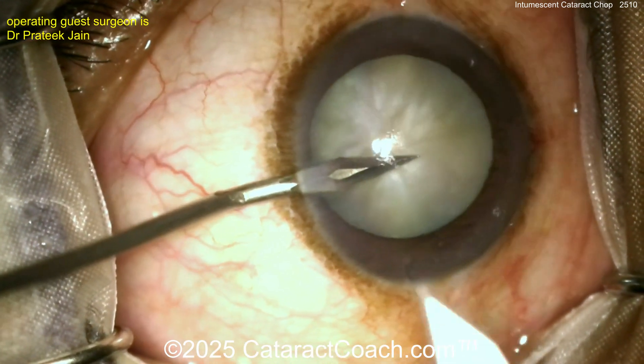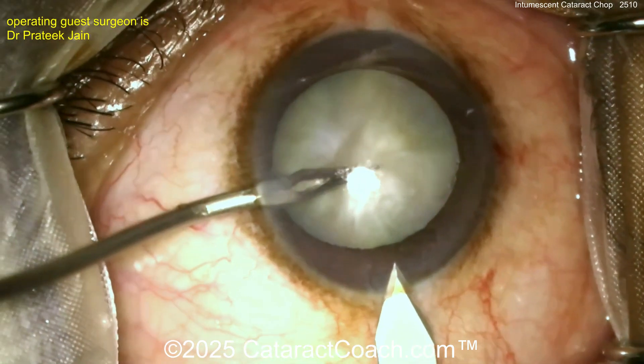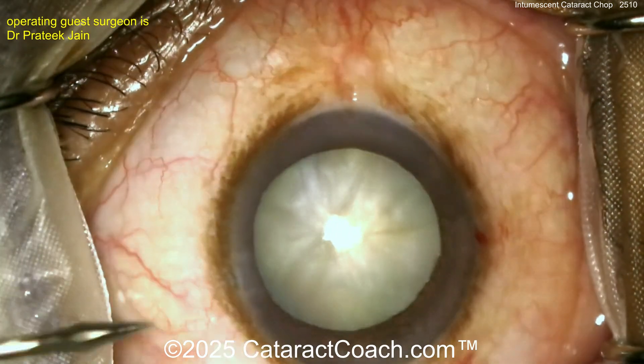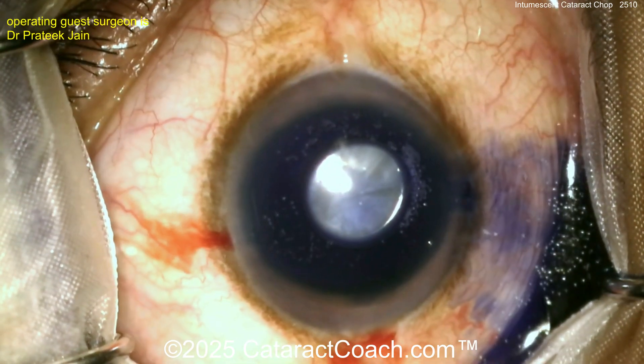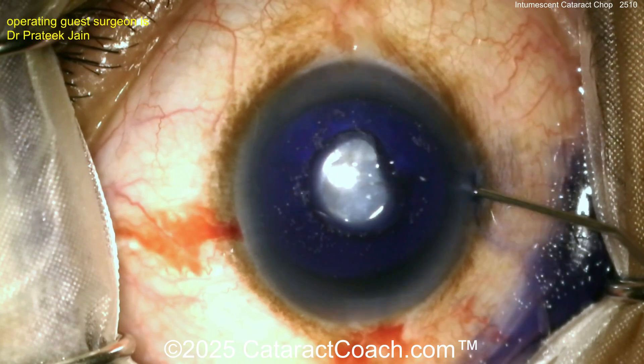Holding the eye and starting to make the main incision with the keratome — that looks pretty good. So you've got a nice main incision and two paracenteses — three incisions total. How about a little trypan blue dye? There it is with an air bubble technique first. I like that technique as well — beautifully done.